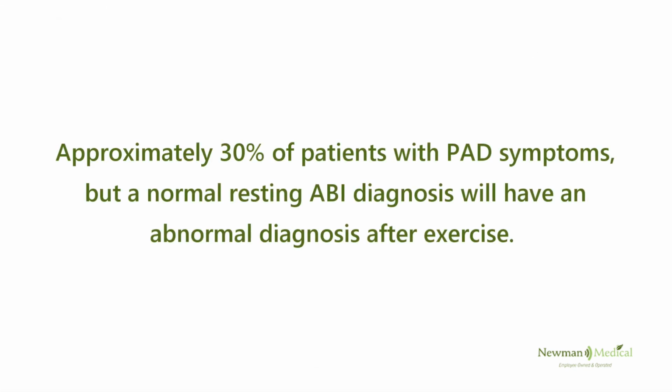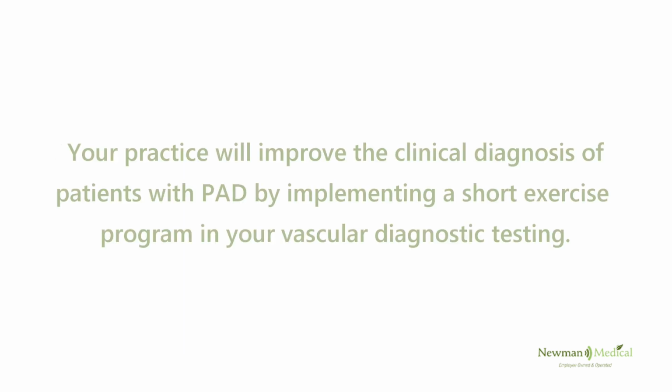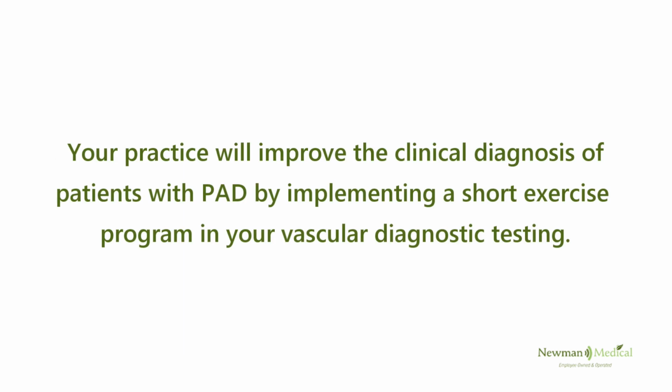Note, approximately 30% of patients with PAD symptoms but a normal resting ABI diagnosis will have an abnormal diagnosis after exercise. Your practice will improve the clinical diagnosis of patients with PAD by implementing a short exercise program in your vascular diagnostic testing.